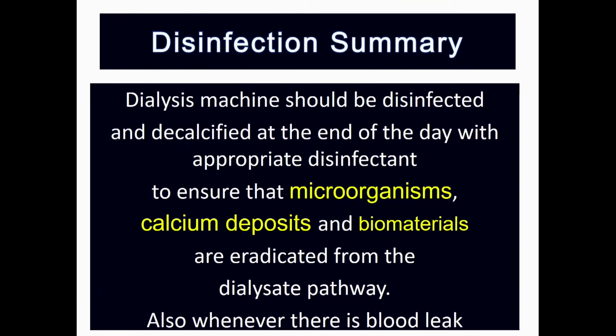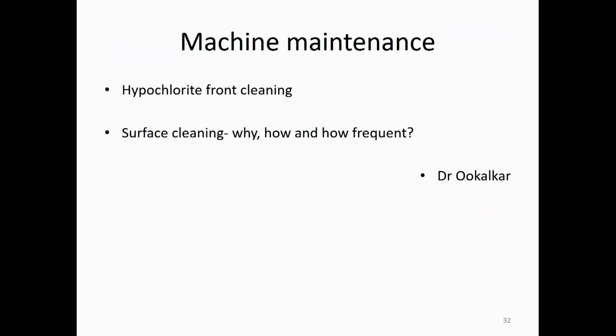So the dialysis machine should be disinfected and decalcified at the end of the day with an appropriate disinfectant to ensure that microorganisms, calcium deposits, and biomaterials are eradicated from the dialysate pathway. And of course, we forgot that in between, if there is a blood leak, then the disinfection should be done, not waiting till the end of the day, but after every blood leak. So sir talked about front cleaning. So Dr. Ookalkar will elaborate.